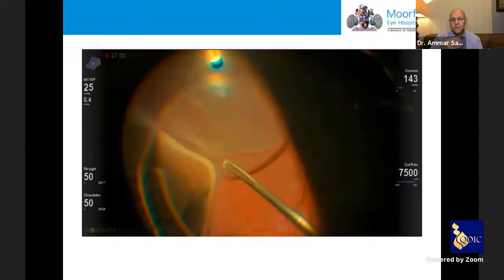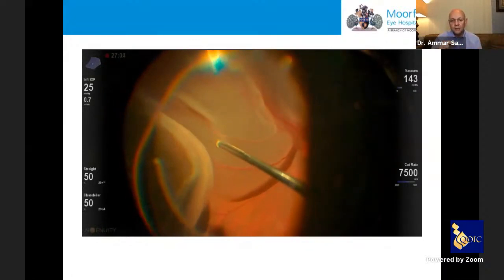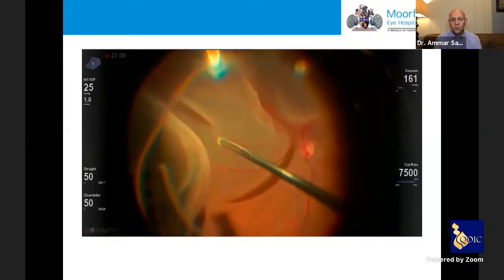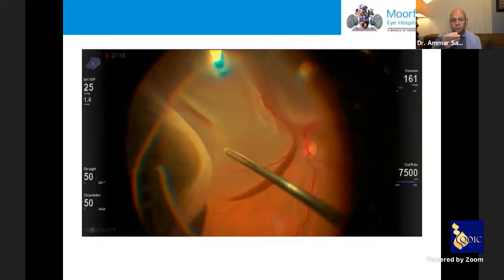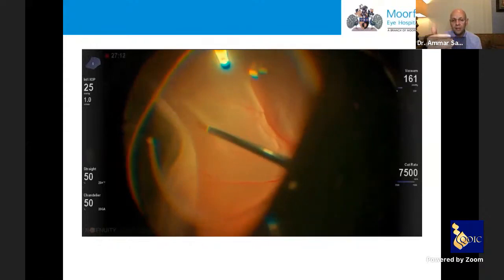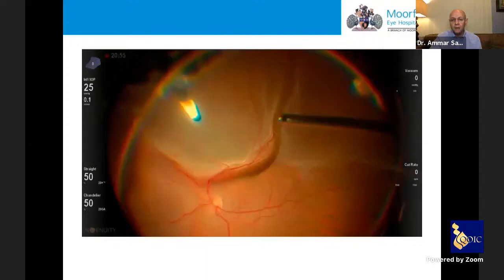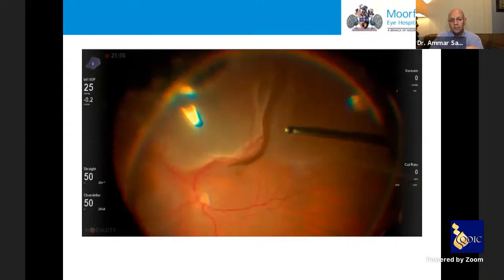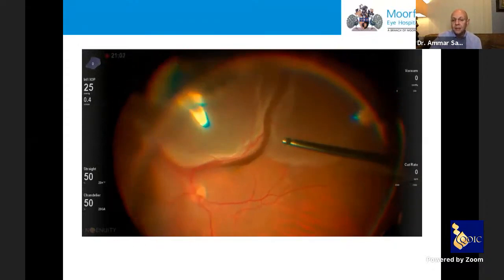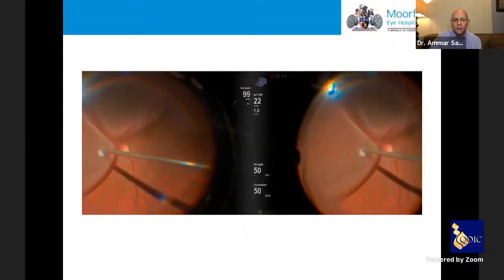The ability to see multiple levels simultaneously is very important. In this retinal detachment case I'm shaving the anterior vitreous — you can see where I'm shaving, the detached retina, and the posterior pole and optic nerve quite well. This illustrates how you can see all these layers at once. Here I'm removing sub-retinal fluid: you can see the fluid getting out of the hole beautifully while also seeing the retina and posterior pole in very good resolution.